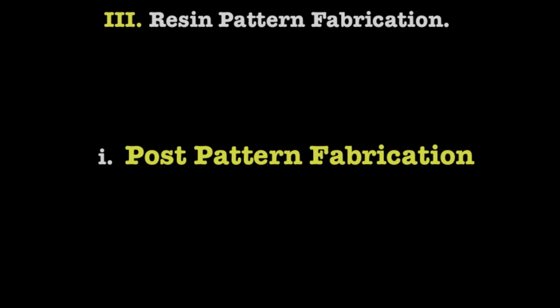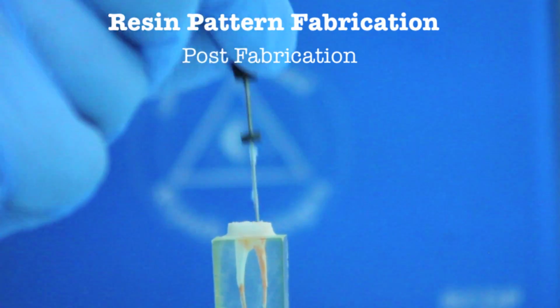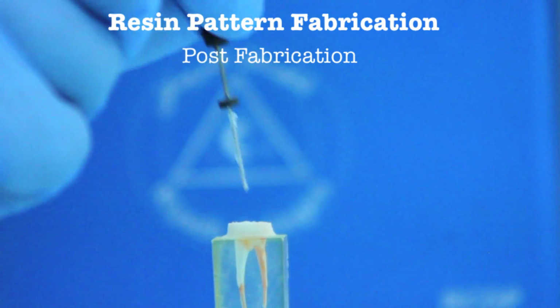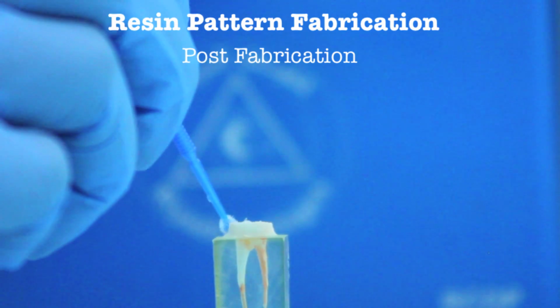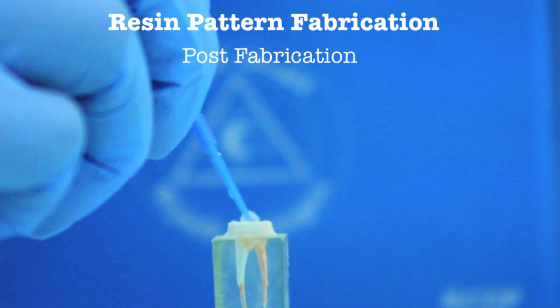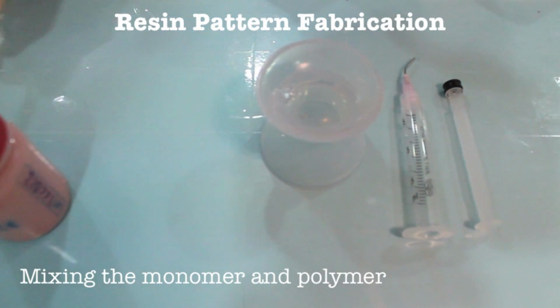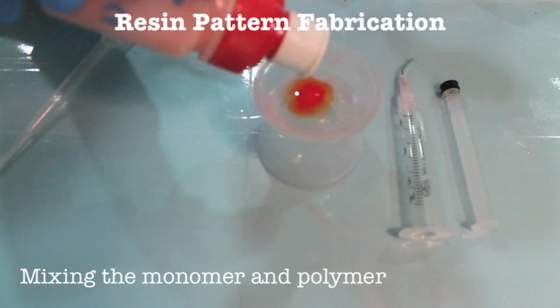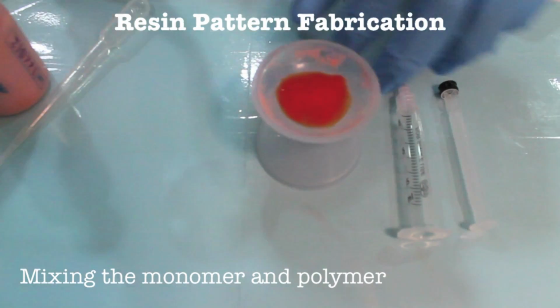Third, resin pattern fabrication. Post pattern fabrication. The canal is lubricated with petrolatum jelly using an endo file and a small brush. Care must be taken to remove any excess of petrolatum jelly before proceeding with pattern fabrication. In a dampened dish, acrylic resin, monomer and polymer are mixed to a runny consistency and applied in the syringe.